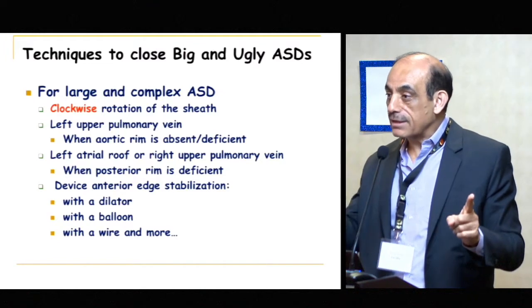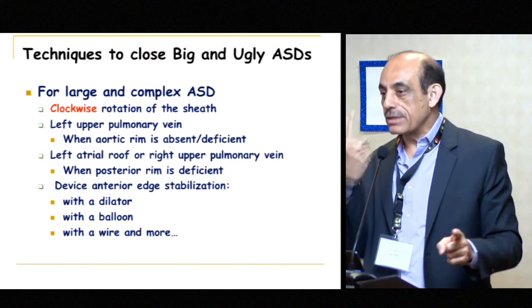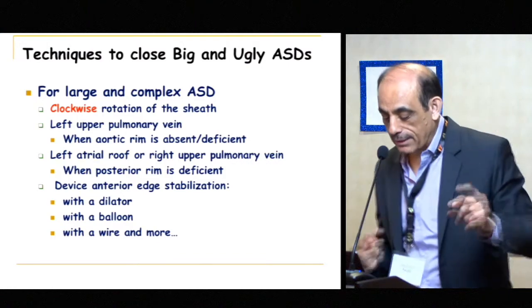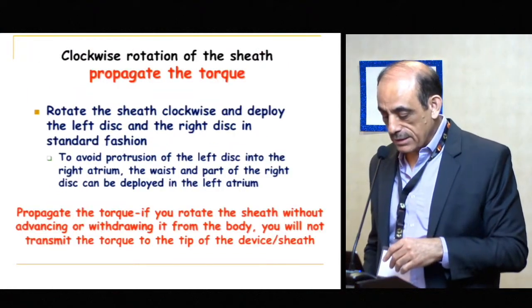So remember, everything you are doing is essentially straightening this delivery sheath parallel to the spine in AP, not the LAO, remember that. Okay, and then there are many other ways, dilators and balloons and all that stuff.